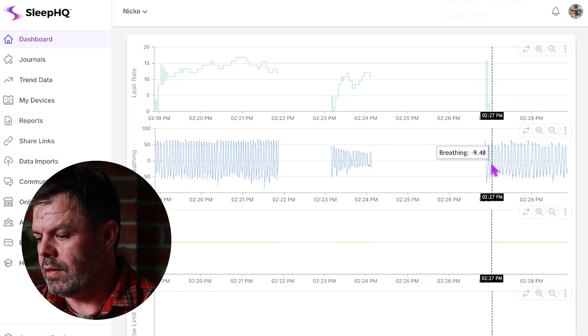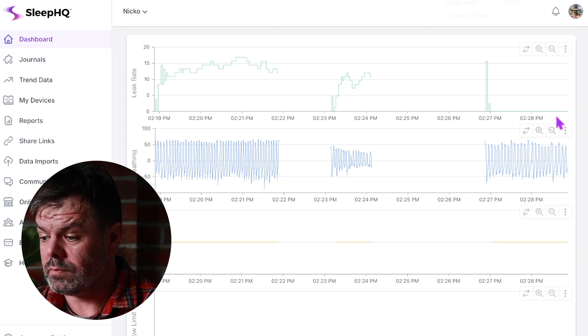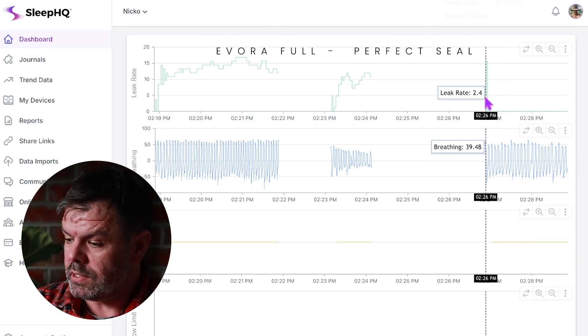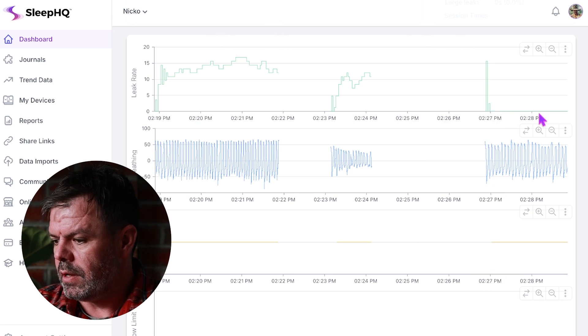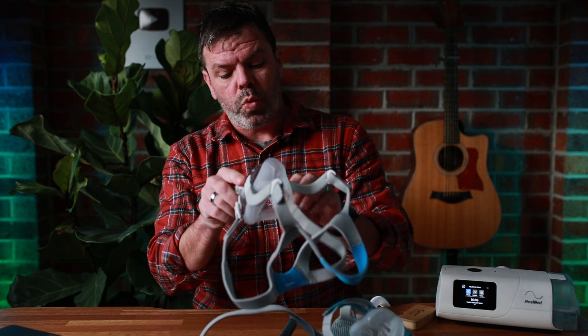Here we have the Fisher & Paykel Evora Full — perfect seal. There was a little blip at the beginning when I was starting the mask, but then no mask leak at all. Very, very good. Now let's check out the AirFit F20.